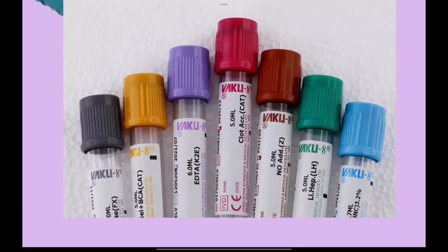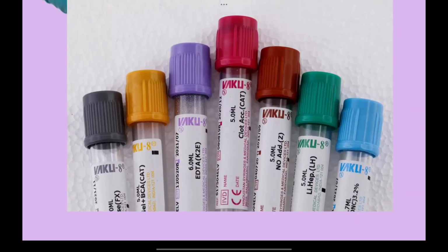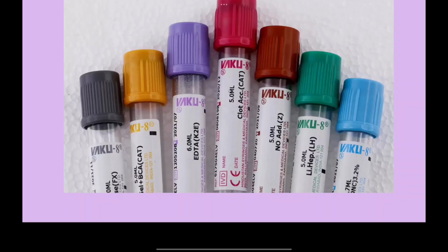Each color determines the different test that is being conducted using that. You have markings also. You see those black markings on each tube. That is the level till which the blood should be filled. Each tube has a small black marking, a box kind of thing. Till there it should be filled.